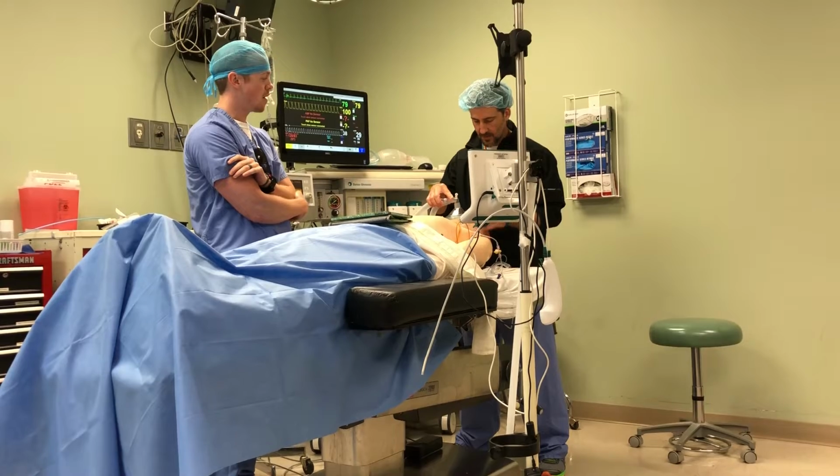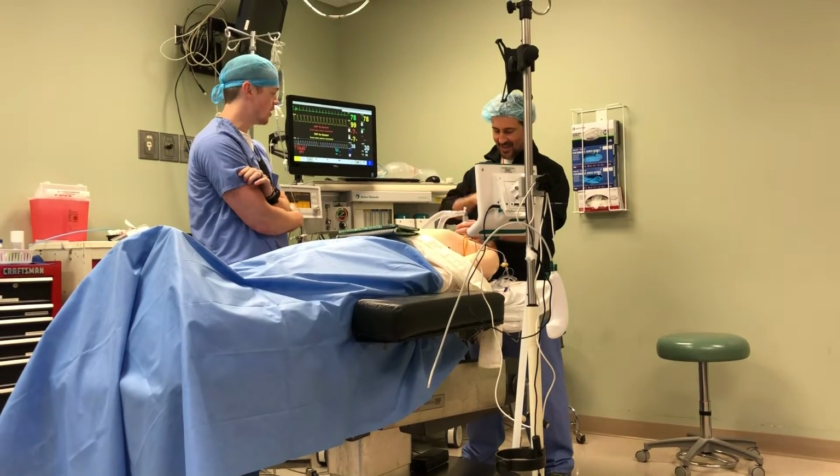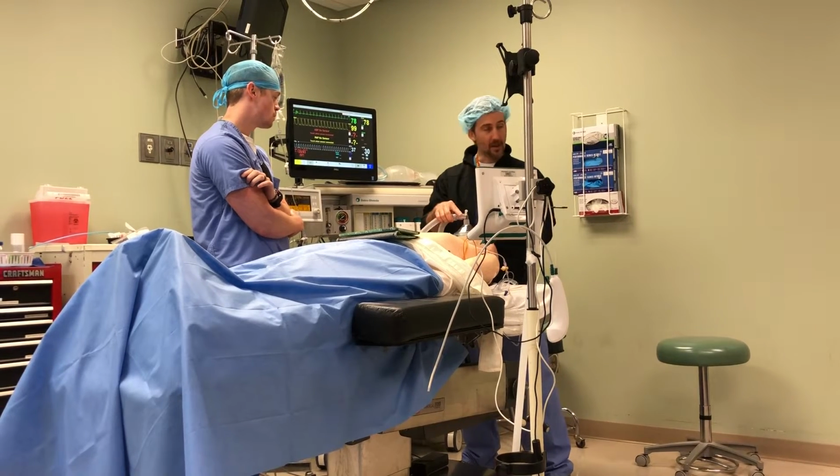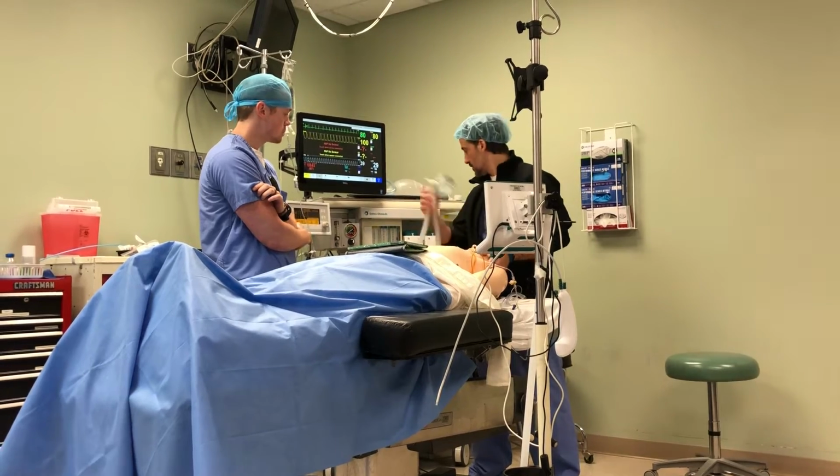There we go. Sleepy eyes, I think he's asleep. There we go. He's asleep. All right. He's lost lid reflex. So I've checked. I'm now going to verbalize. I'm going to tape his eyes. Tape his eyes. Then we're going to place the LMA. So I'm going to take this off.